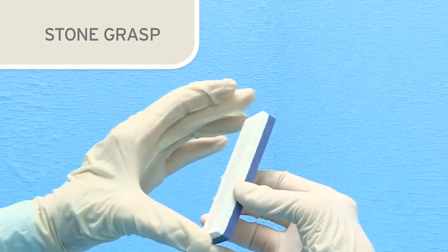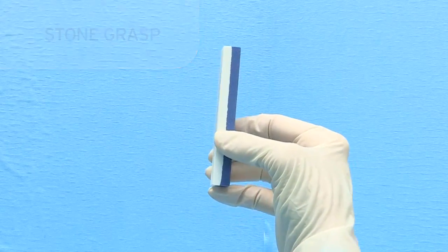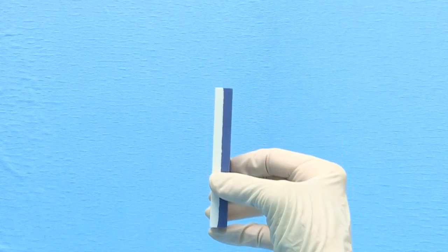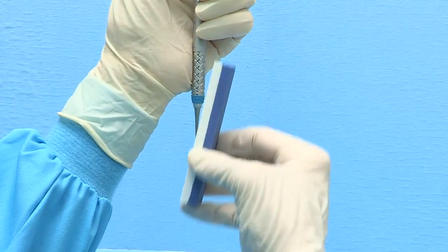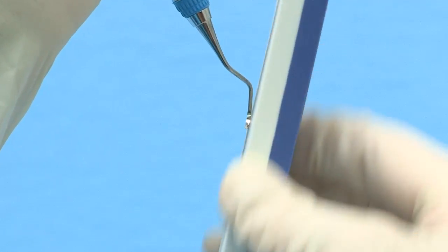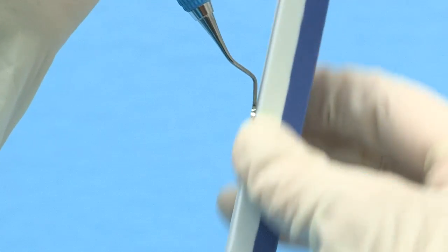The same stone grasp is used when sharpening either sickle scalers or curettes. The grasp should be on the lower half of the stone with the thumb on the edge toward you and fingers on the edge away from you. This stabilizes the stone and assists in maintaining a consistent vertical motion during sharpening, and will also minimize the tendency to move the stone with a rotating or rolling motion, which may dull the end of the blade.